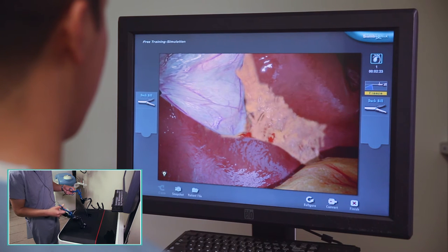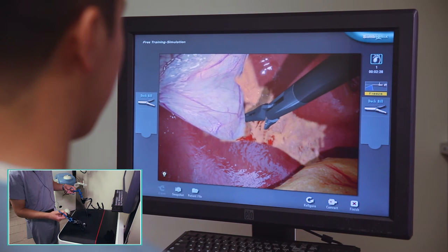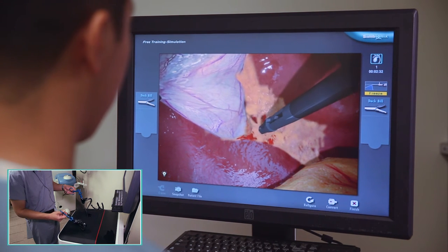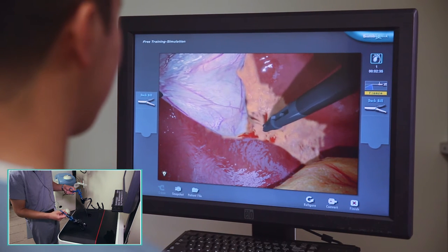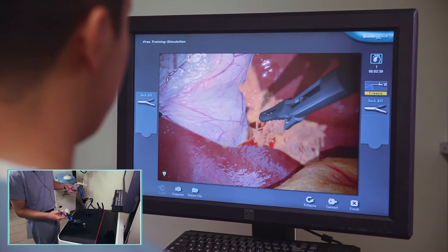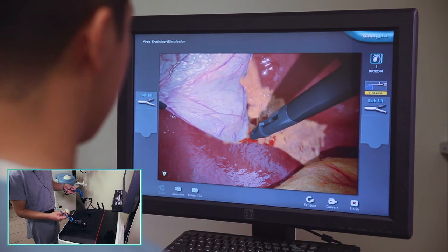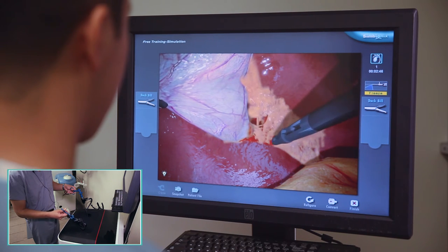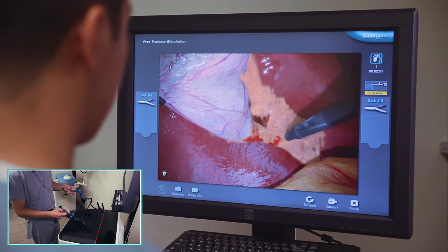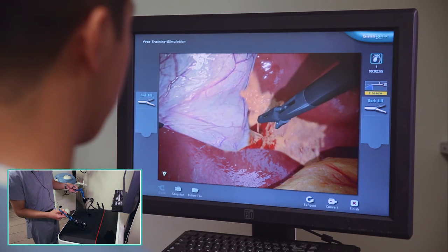You might have seen that a hint just popped up on the screen. This might be a little confusing, but the hints are just going to pop up when the machine knows that you're working on a certain area — it doesn't mean that you're doing anything wrong. You can see I've started to define a little bit of my anatomy. You can see that the cystic duct is traveling sort of in this direction, which is where we expect it to be. I'm just going to continue to free up the adhesions that are obscuring the view here.